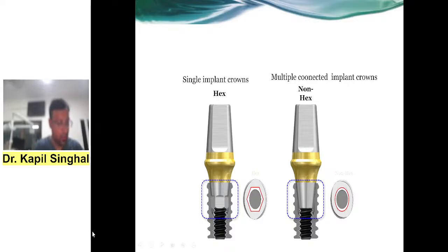When there is more than one adjacent implant, it should be non-hex.